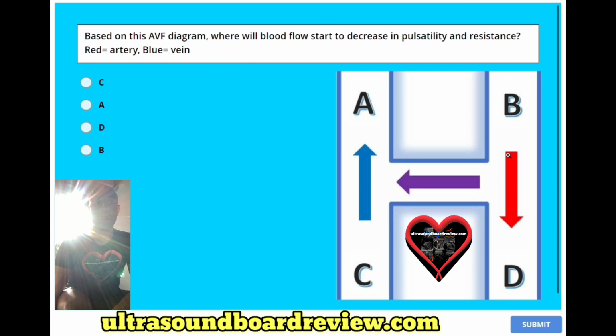The answer is right here in this region, so B is the answer.